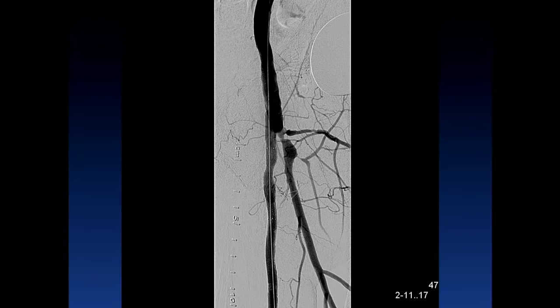So I think this is an example where retrograde SFA access really can make a lot of sense. I find this an extremely useful access technique for ostial SFA occlusions where there's reconstitution at the proximal popliteal.